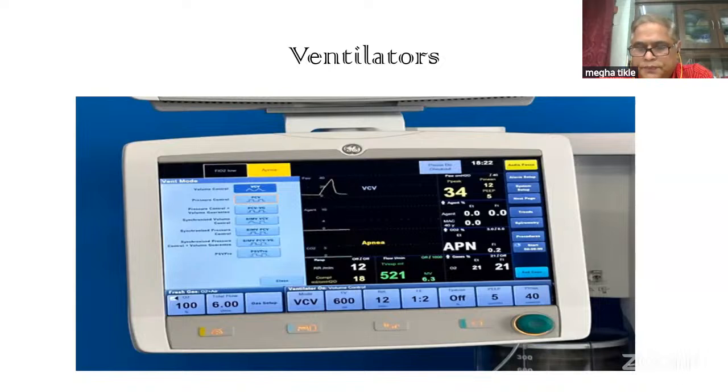In some machines, because of the modular nature, the anesthetic gas mixture is also shown as a part of the respiratory gas on this monitor, and you can know the MAC of your anesthetic agent. You can have the inspired and the expired concentration of gases, both are there, which is very necessary when you are using it for intermediate flow or very low flow metabolic flow anesthesia.